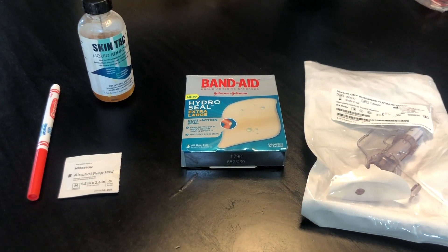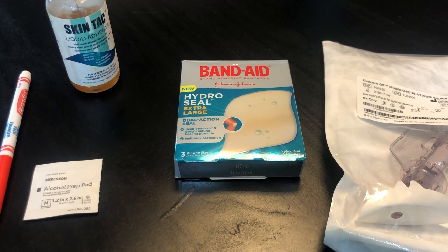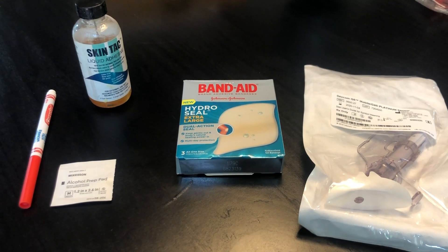I've had a lot of questions about how I use the hydrocolloid bandages as a barrier between my son's skin and the adhesive on the Dexcom sensor, so I'm putting together a little tutorial.